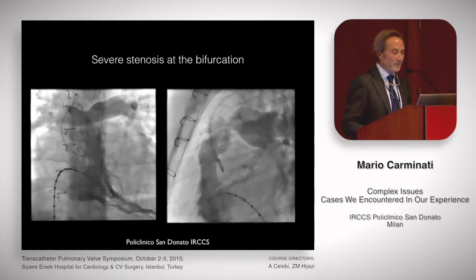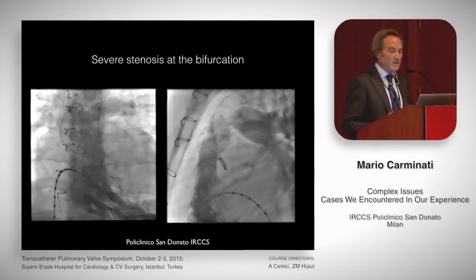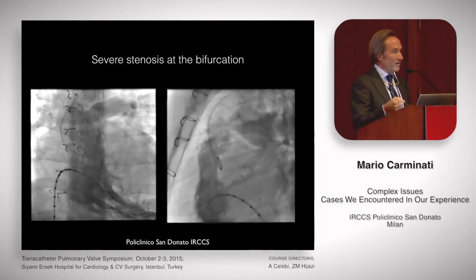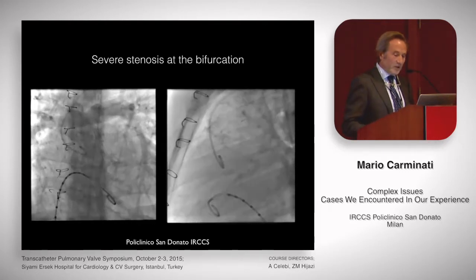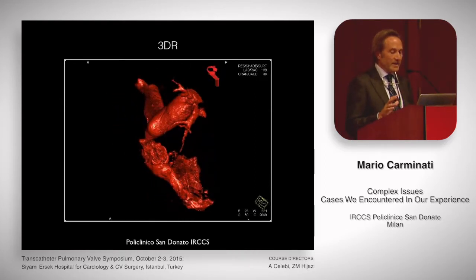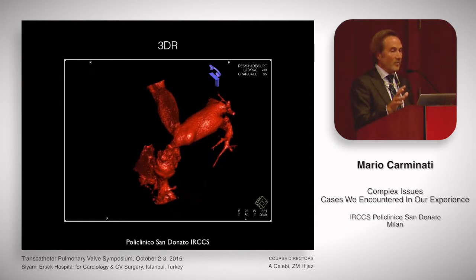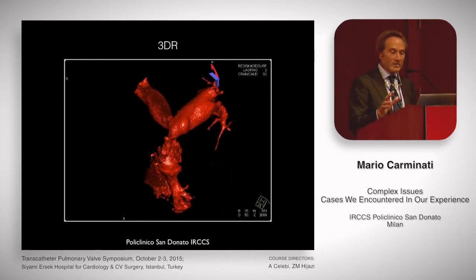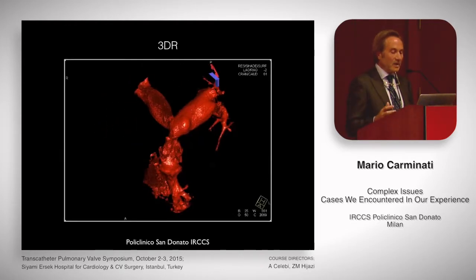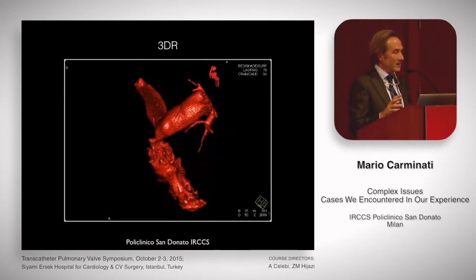This is the angiogram performed in the cath lab. You see in AP and lateral projection the severe supravalvular stenosis very close to the bifurcation. We also did a 3D rotational angiogram to better understand the anatomy. You see the severe stenosis involving the bifurcation of both right and left pulmonary branches. So this is going to be complex — with this kind of anatomy it's not easy to implant a stent properly.